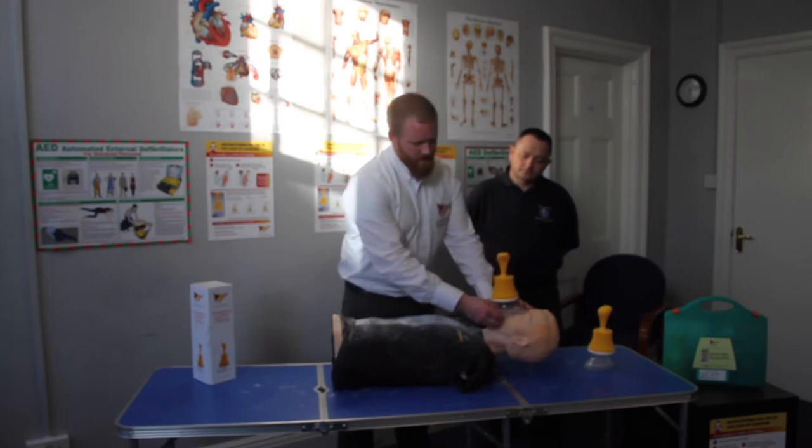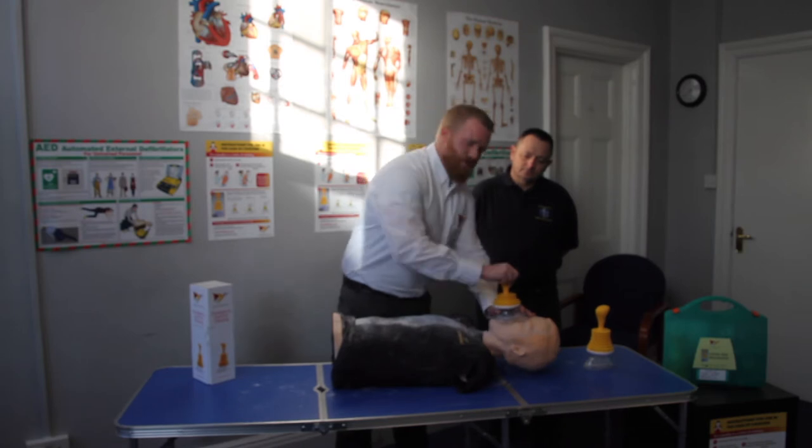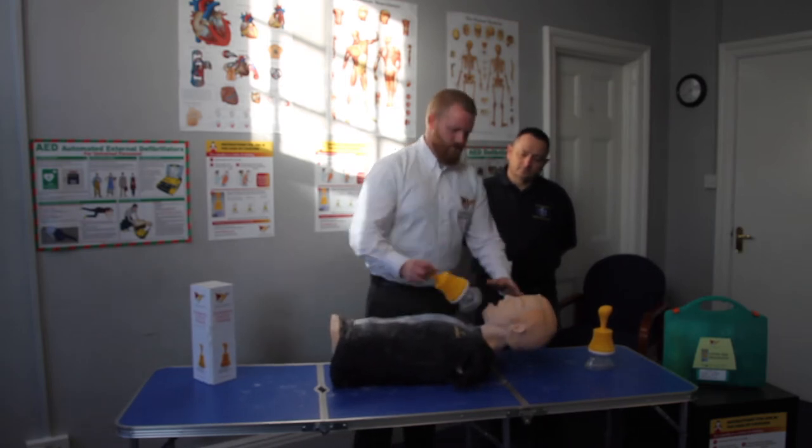Without the seal, there will be no suction. With your other hand, go on top of the LIFEVAC, and with a quick motion, push and pull. You have just saved the resident's life.